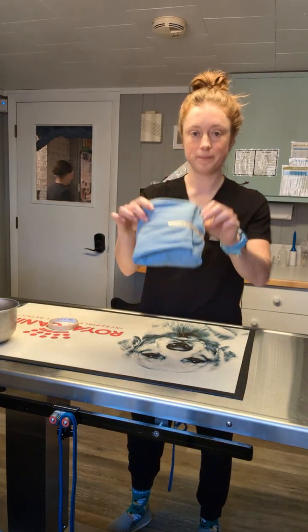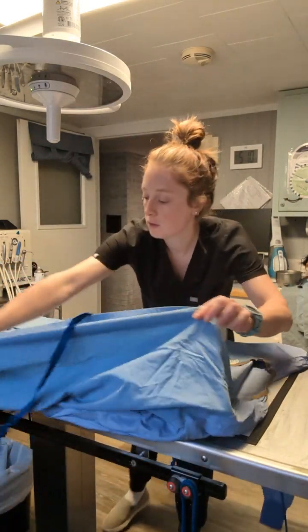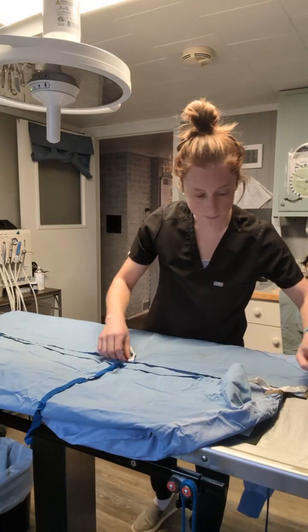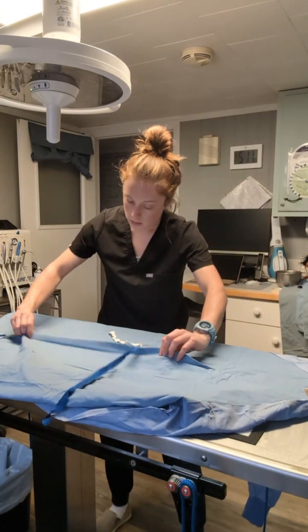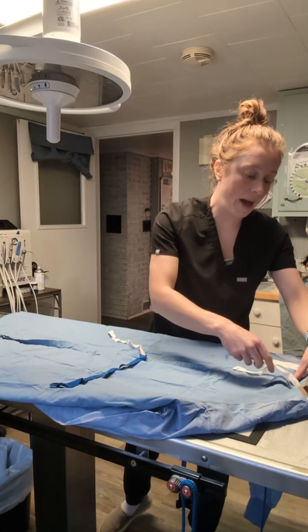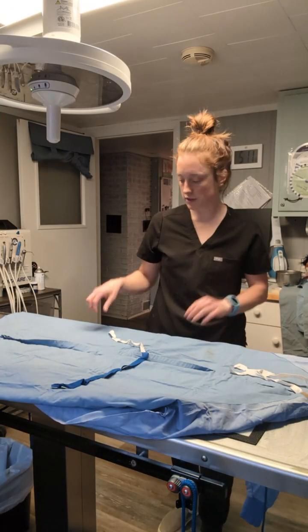It's like that when it's done. So to wrap a gown pack, I want to lay out the gown with the open side up just to make sure that the panels line up. And ideally we want as easy access to the open back collar, because that's where we're gonna get into the sleeves.